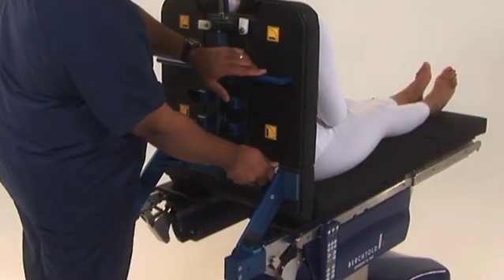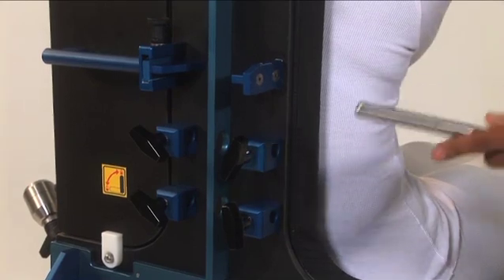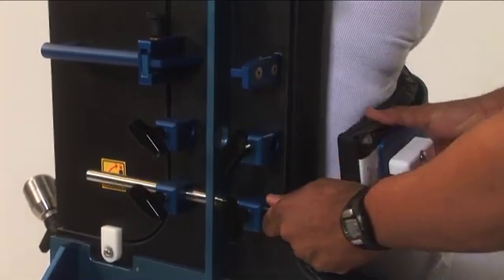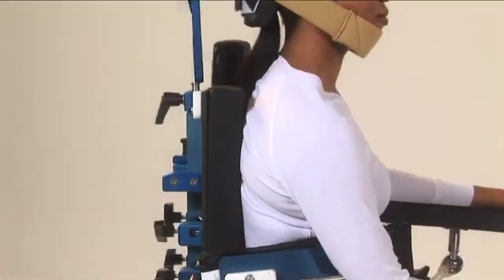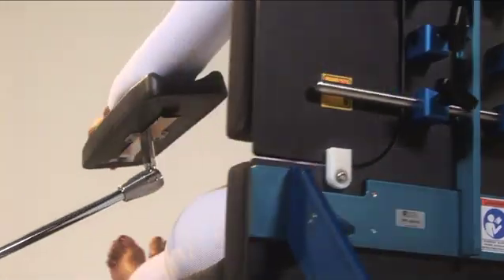To position the lateral brace, remove the shoulder panel on the operative side and slide the brace into the clamps. Adjust the lateral brace to fit the individual patient's size. Lock tight by turning the locking handles. The lateral brace is height adjustable. The straps secure the arm to the board.